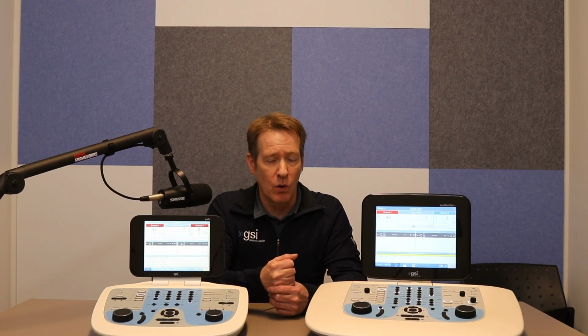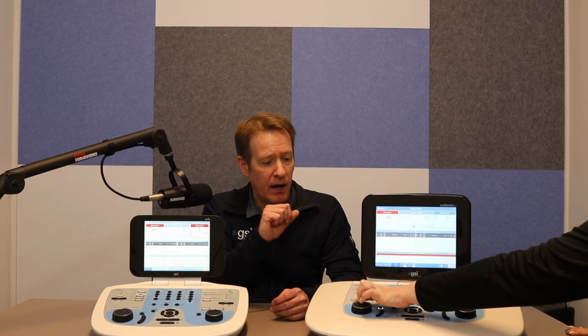So once you uncheck that, that'll allow you to score that sentence as many times as you want, move on to the next sentence, and again, going through and scoring the test more appropriately. And then when you transfer, you're getting the proper percentage. So that kind of covers the options that you have for the autoplay.